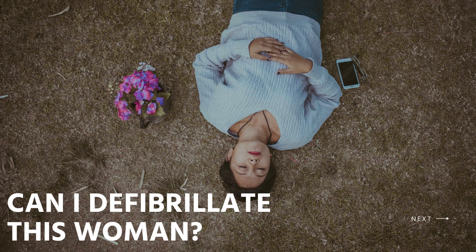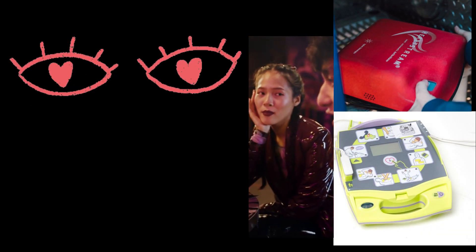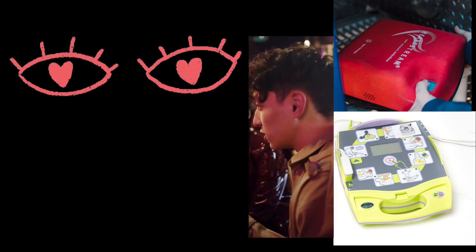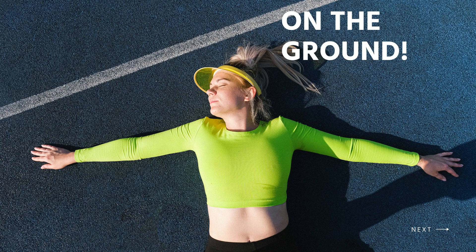Did you know that women have lower chances than men to be resuscitated and survive out-of-hospital cardiac arrest? Can I defibrillate this woman? Ask yourself — yes, you can, even as an untrained bystander. With simple audio and visual commands, AEDs are designed to be simple to use even for the layperson.